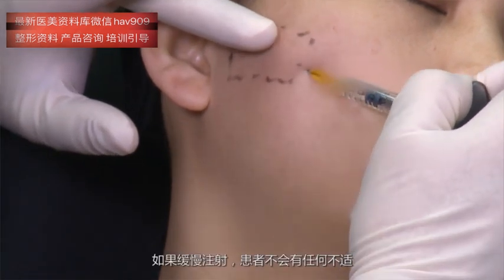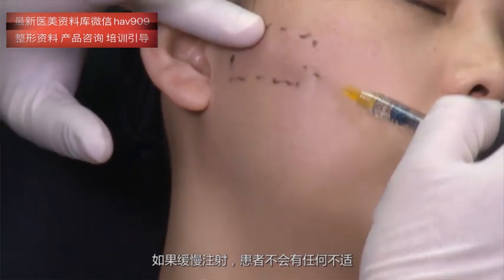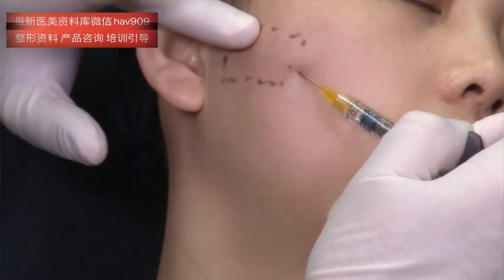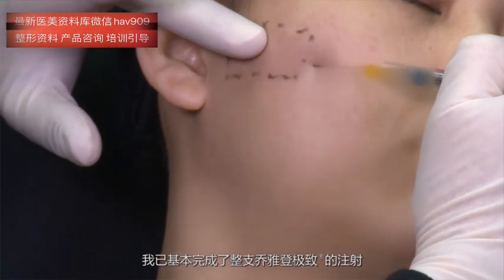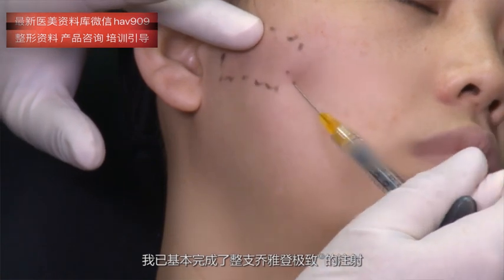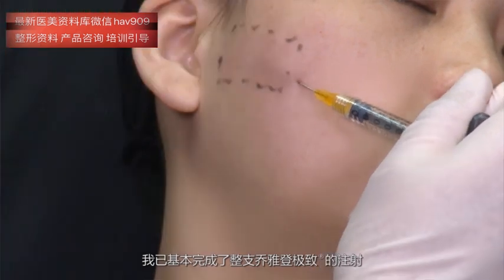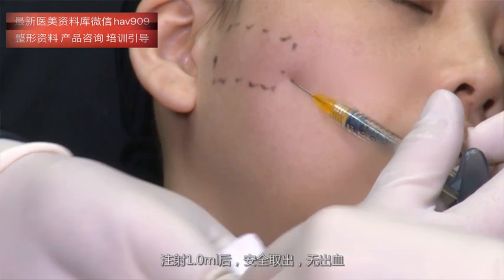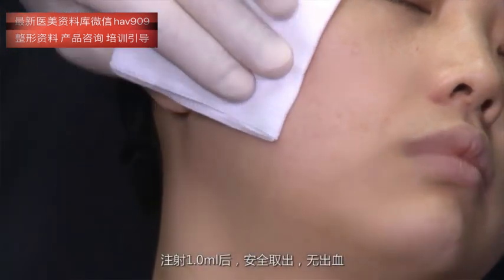If you inject slowly, the patient will not suffer at all. So I am almost finishing with a full syringe of Juvederm Ultra Plus. After 1 ml, we simply take out, no bleeding.